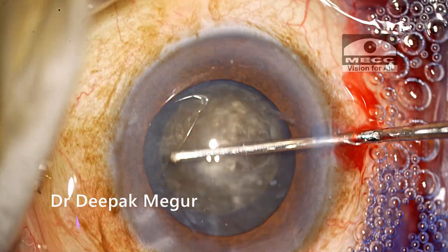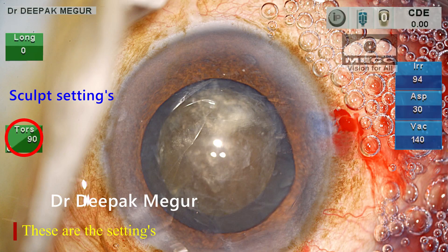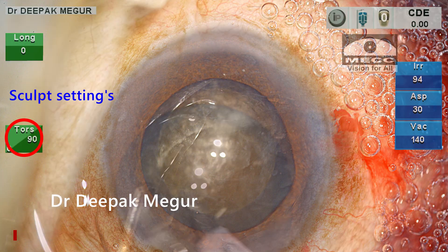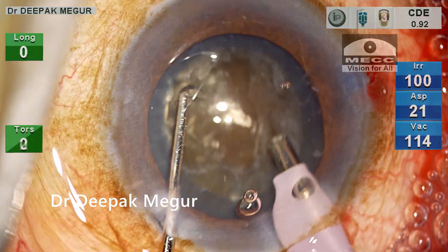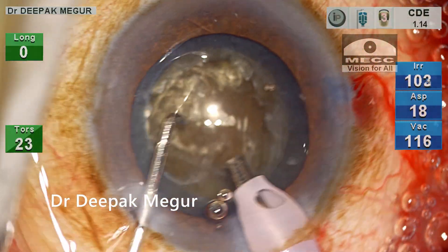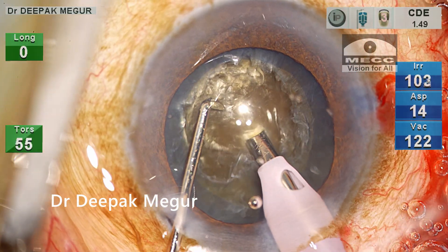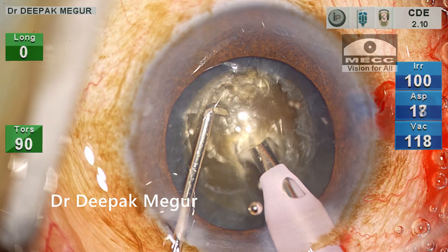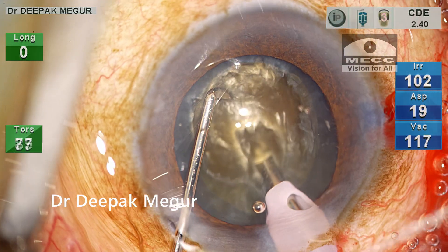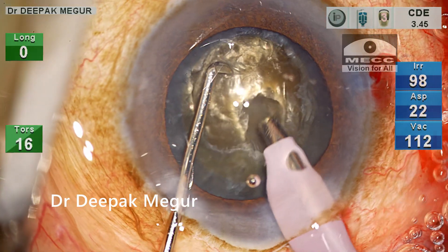Since this is a hard nucleus, I need to get a very good grip on the central deeper part of the nucleus for successful chopping. To access the deeper part of the core nucleus, I'm creating a small central pit so that I can bury my tip deep into the central core, which will help me crack the posterior plate more efficiently.